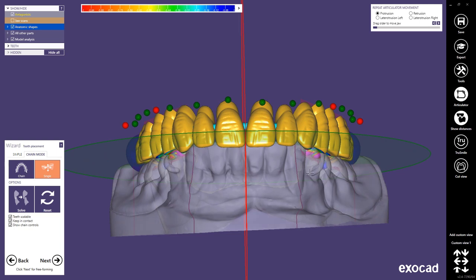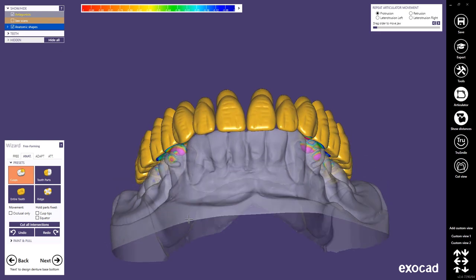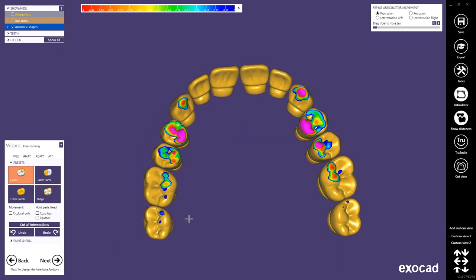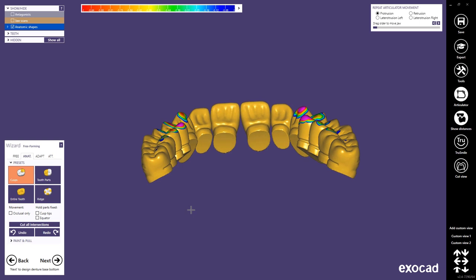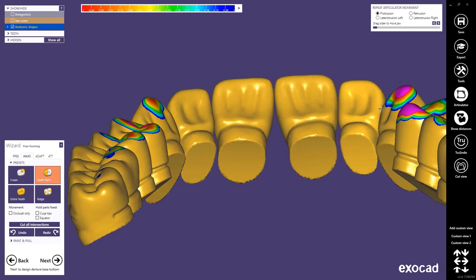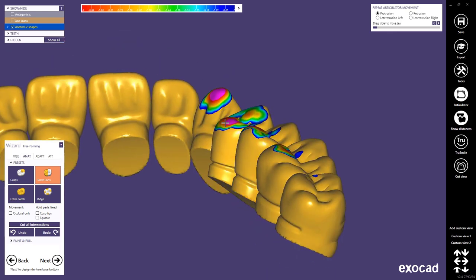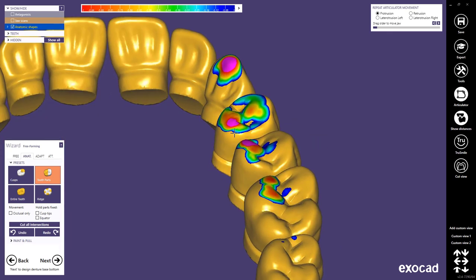For small corrections of individual teeth I use the single mode to only move one tooth at a time. Once I'm happy with my tooth setup I press next to get to the freeform mode. Since I selected a scalable tooth library I can change the teeth in any way I want using my classical freeform tools.